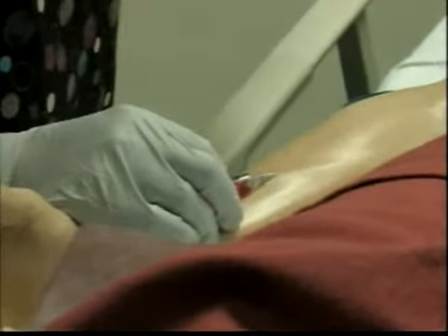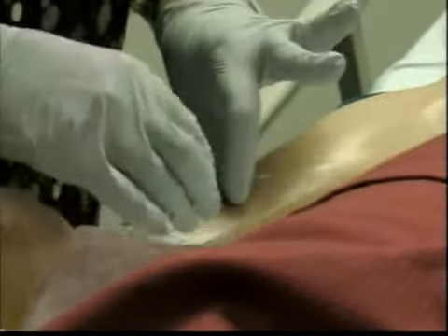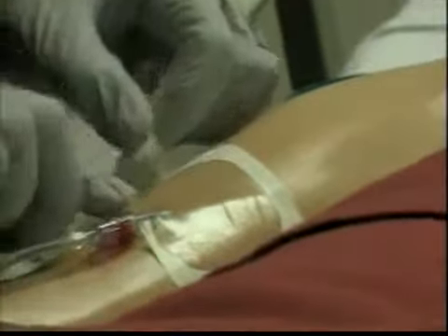If it's a client that is confused, you want to make sure that you tell your partner and say, I'm going to remove this, please keep him still. And then you're going to remove it, and you're going to get your Tegaderm, and you're going to cover the hub of the catheter with the Tegaderm. You're going to remove and save that part because you have the number in here for the date and the time.